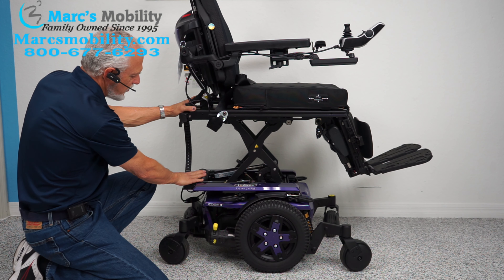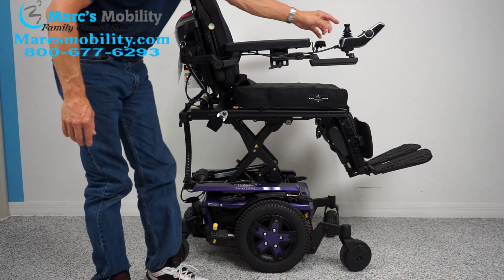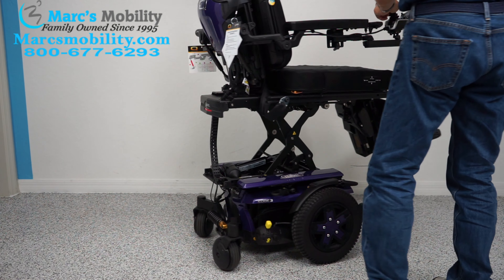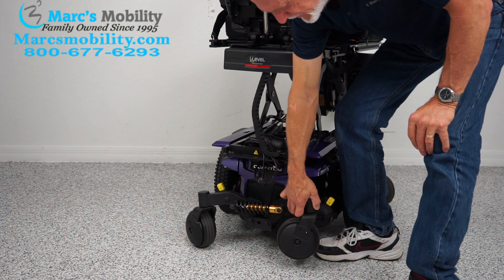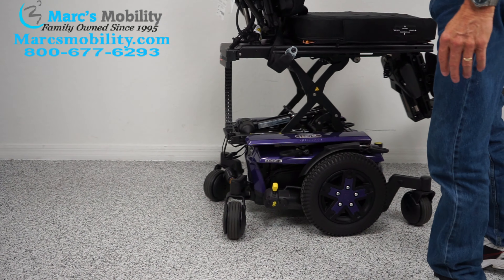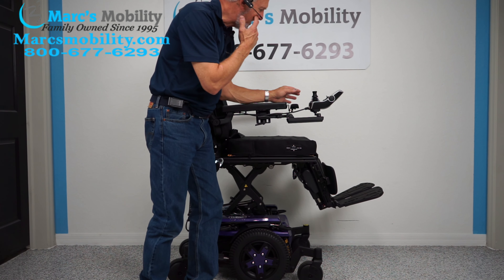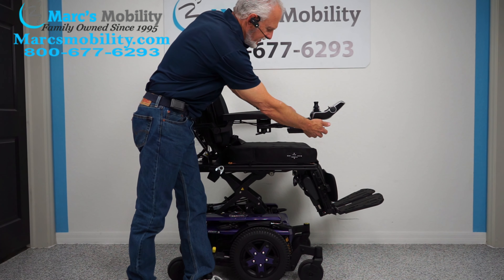Now you can see the armature for the seat lift — look at how well constructed this is. This is an X-frame seat lift. You can see the motor right here for the actuator making the seat go up. I want to show you the suspension on this chair. Look at the front — there are two large shocks on both sides. And if you look back here, you have the same suspension in the back. These are independent forks; if I raise this one, the other one stays on the ground. Independent suspension. I just don't know how much better they can make these chairs. Five years ago they started improving these chairs, and now they're just so good.